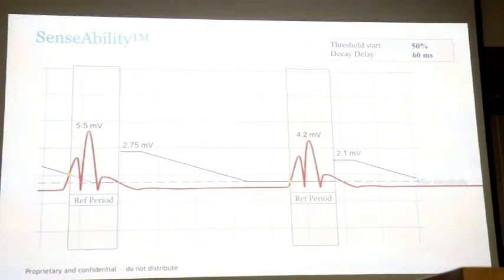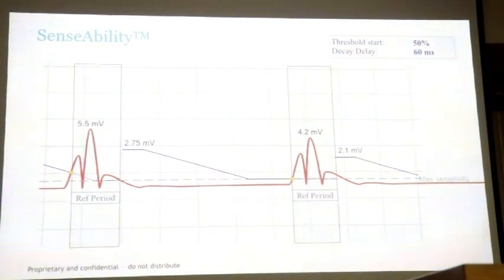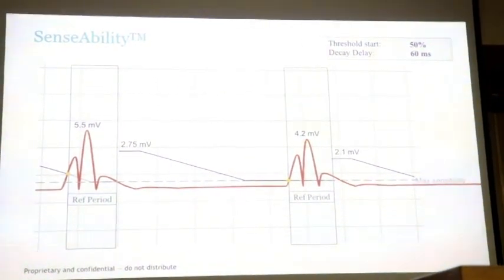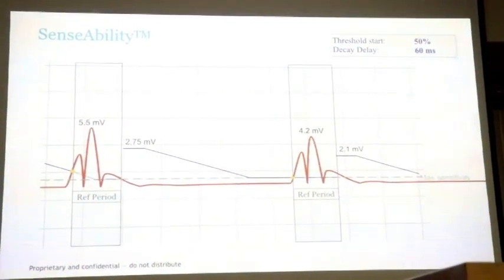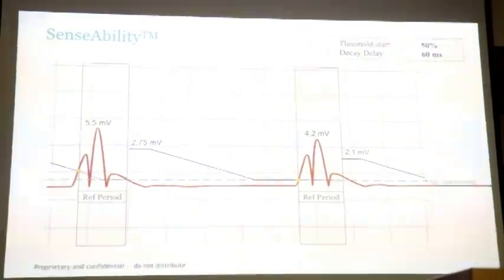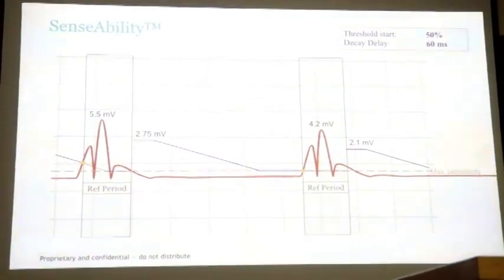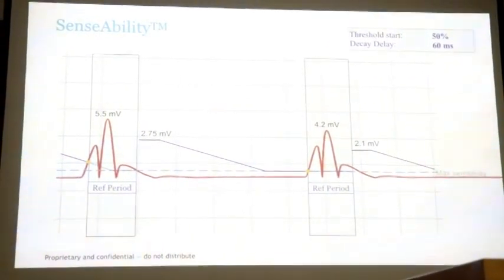It's really insensitive, so we wouldn't advise that. You want to make minimum changes to get around T-wave oversensing. Saying that, it is really rare for an Abbott device today to have T-wave oversensing. With our current technology, it's extraordinarily rare to see T-wave oversensing when you're sensing.